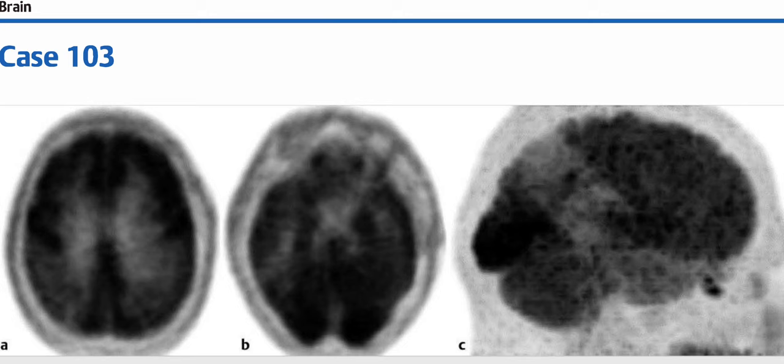The attenuation corrected FDG PET maximum intensity projection image in the sagittal view shows decreased activity in both the parietal and temporal lobes, with intact normal activity within the cerebellum and the frontal and the occipital lobes. So considering this key finding of decreased cortical 18-FDG activity in the setting of dementia, the top differential here is Alzheimer's disease. Other than that, you can add multi-infarct dementia, Pick's disease or Parkinson's disease in the differentials.